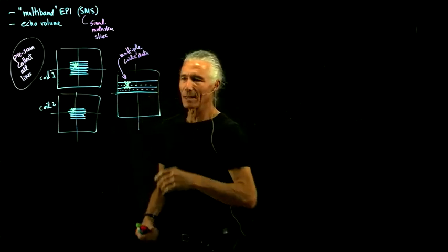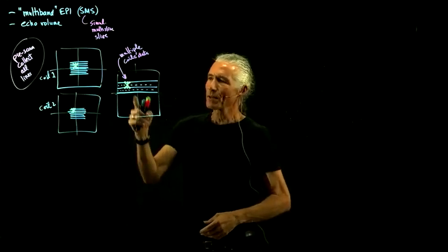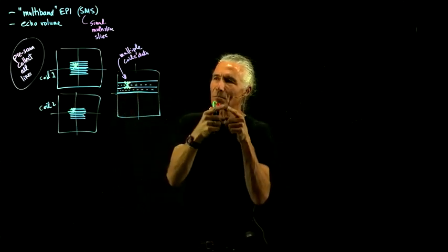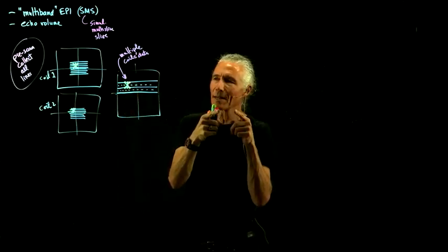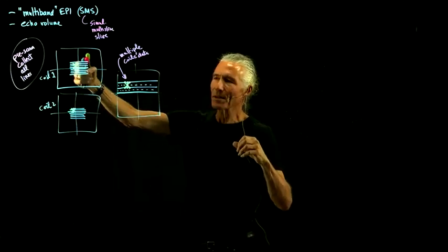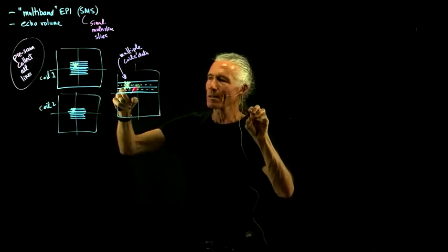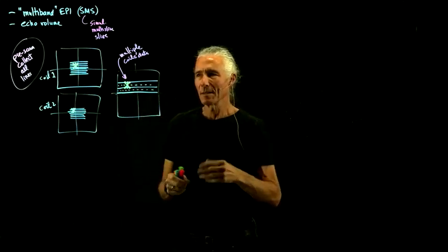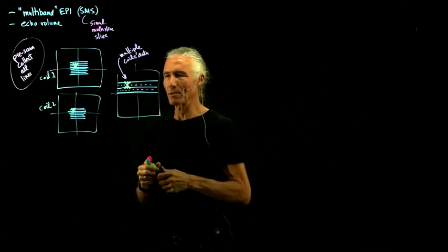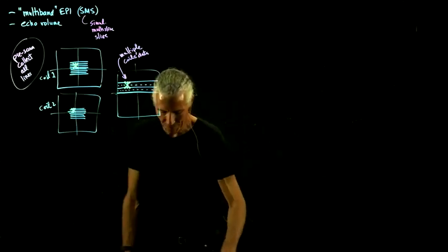You leave out data in k-space, and then it fills it in because each frequency has been smeared out to nearby spatial frequencies by having this local fall-off coil. And so then we collect all the data and then use all the data to make a little filler-inner that will allow us to fill in the data before we do our inverse Fourier transform. And so that works great. So you can collect half the data and still get an image that doesn't have any overlap in it.